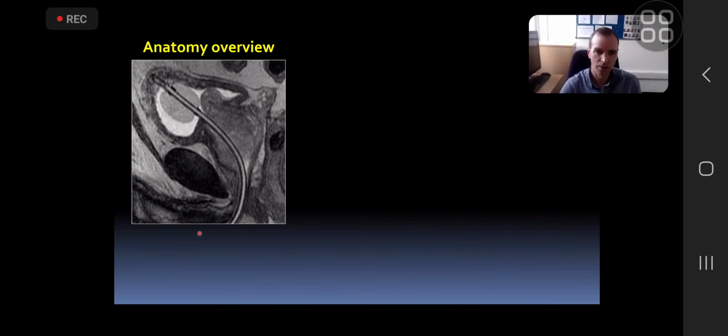So how do we divide the prostate? We go from the back of the prostate, if we think of a line like that, and then we divide it into thirds. And we talk about the base, the mid, the apex. Why those terms? Well, it's sort of like a triangle, or a three-dimensional triangle, a pyramid that's inverted, so it's on its tip. So the apex of that pyramid is at the bottom, the base is at the top, and the middle bit is the bit in the middle.